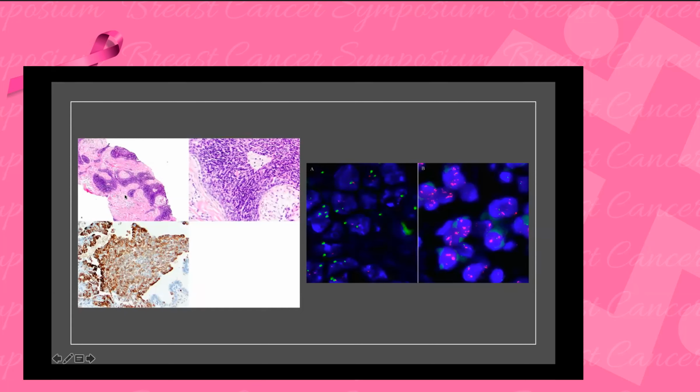So you can see from a lower magnification that your normal architecture is distorted. We don't see the normal breast tissue, your terminal duct lobular units are not there. We're just seeing a lesion that is actively infiltrating our surrounding tissue. And obviously it's easy to say that this is invasive because we've got the architecture, and we are therefore able to perform our biomarkers.